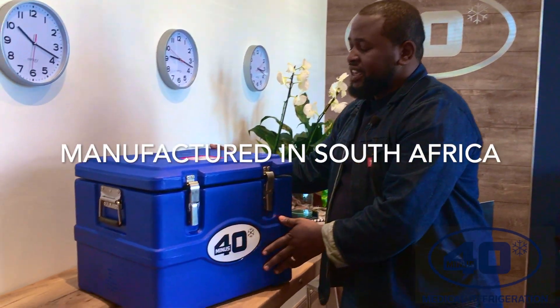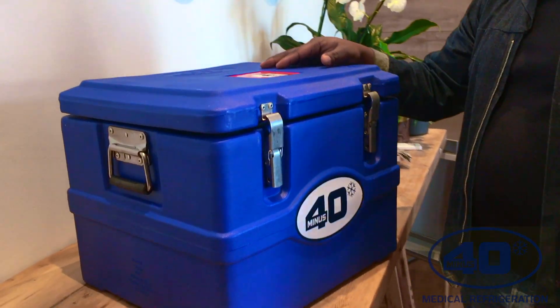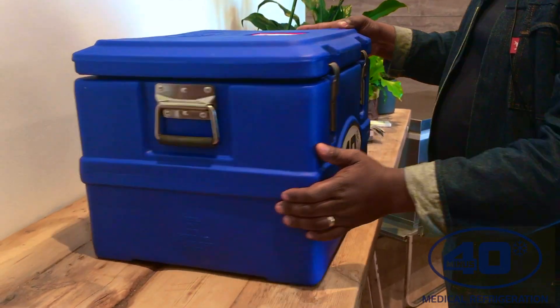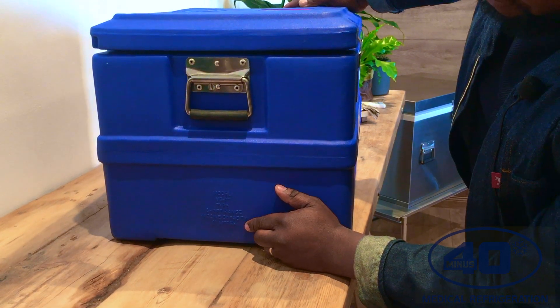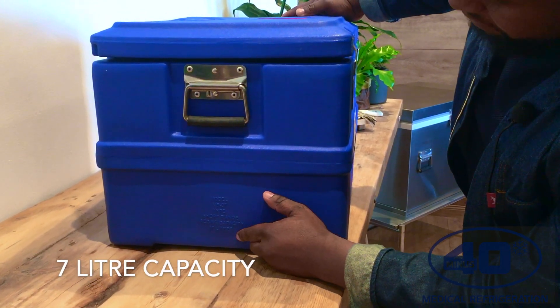...it's a minus 40 product and it's a 7-liter vaccine cold box. You can see from the outside, on the left-hand side right here, we have all the product information. It's a short range cold box and it's also a 7-liter.